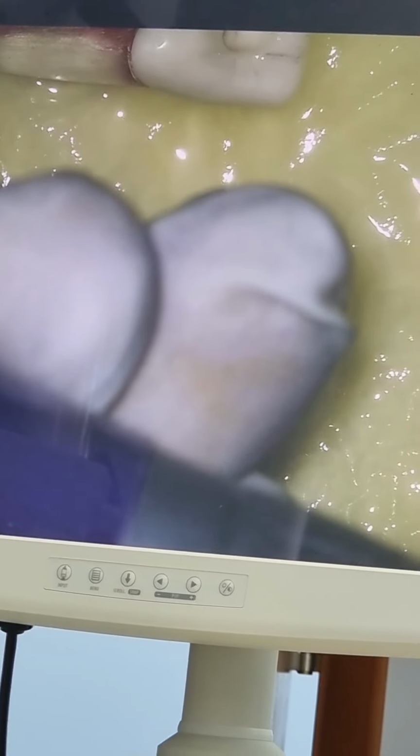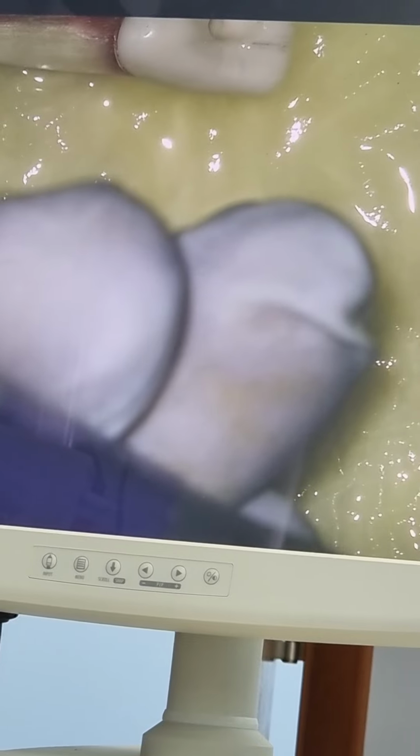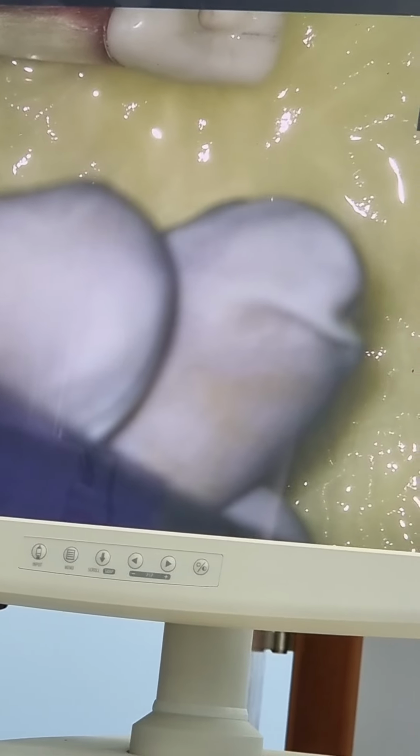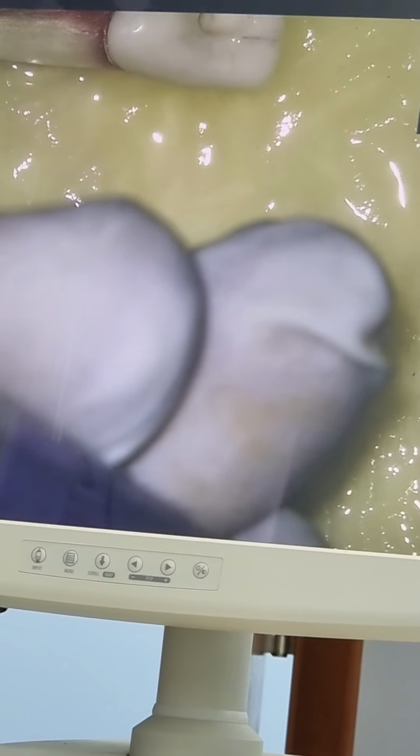If you ask the number, around 1000 RPM is good, because in clinics, the chairs have this setting to adjust the RPMs. Again, this is a mistake the students in the 5th year tend to do. They use the Gates Glidden, but they forget to decrease the RPMs. They use it at the same RPMs in which you use the high-speed handpiece. So what will happen? It will cut more and it will break. It will fracture.